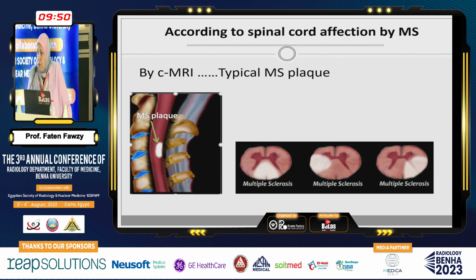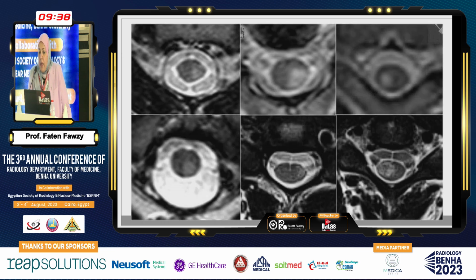The MS usually affects the cord in the form of short segment myelopathy in the dorsal or the lateral aspect of the cord, or dorsolaterally. Accurate selection of the pulse sequences, mainly the proton density on axial and adjustment of the field of view, are all essential to pick up any abnormal high signal within the cord.